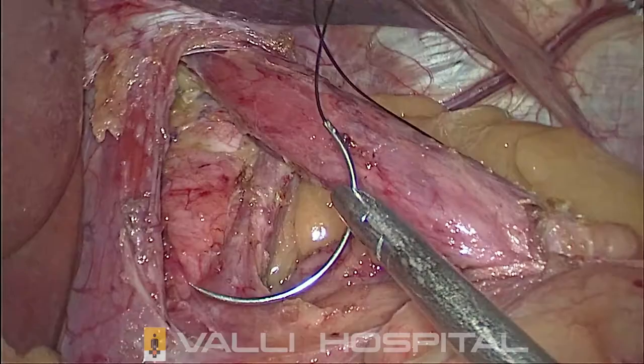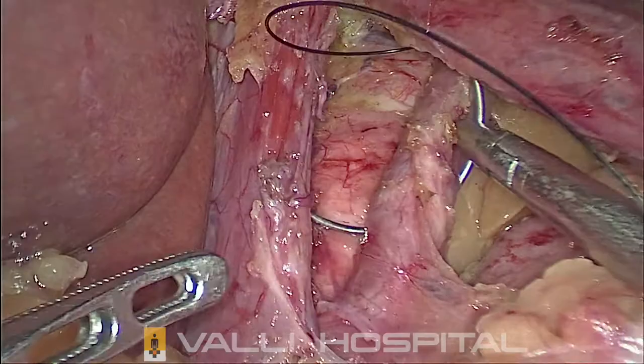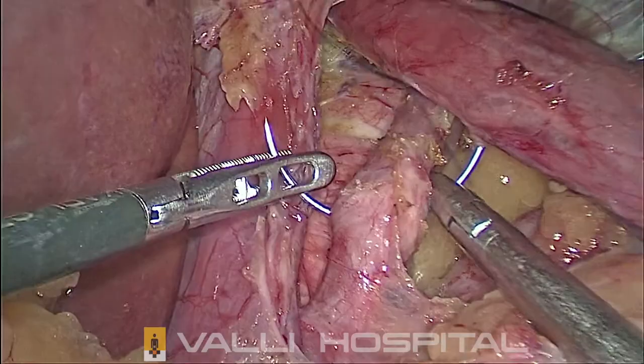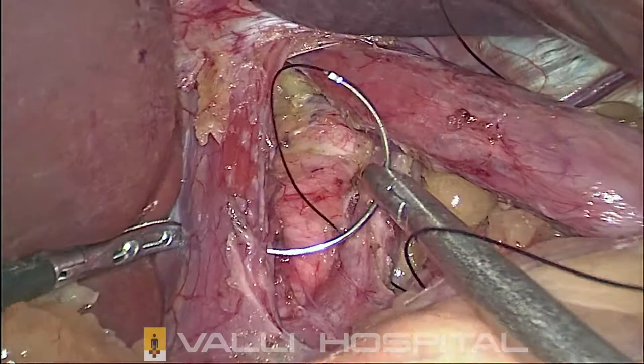Now comes the cruroplasty. The cruroplasty is done at a distance of 1.5 cm. It is a rule of 1.5 cm. That is 1.5 cm from the confluence of the left and right crura, and each stitch must be at a distance of 1.5 cm and you leave a gap at the top 1.5 cm. Rule of 1.5 cm.